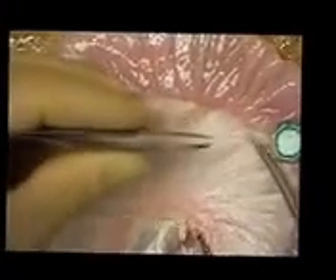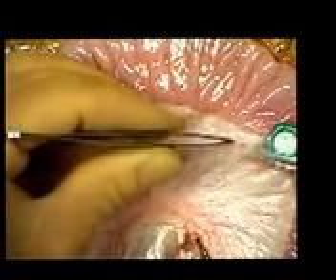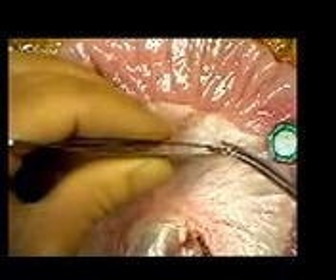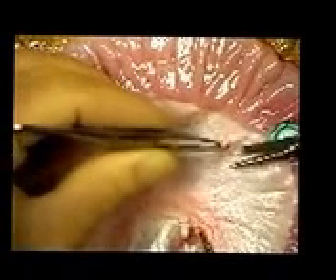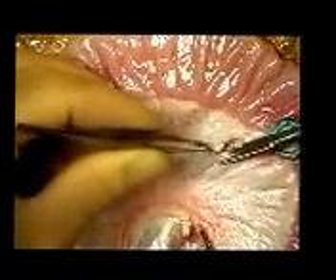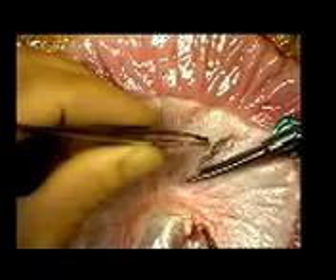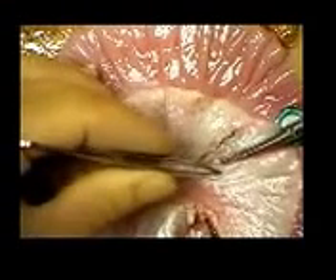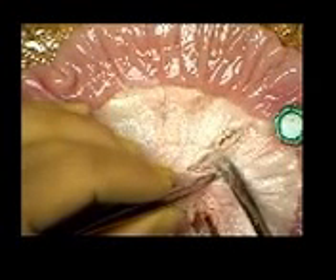The anterior layer of the peritoneum is dissected away from the underlying vessel using curved Mayo scissors. The vessel is then gently freed from the underlying peritoneal layer. A free window is created around the vessel through which the tips of a hemostat can be introduced.